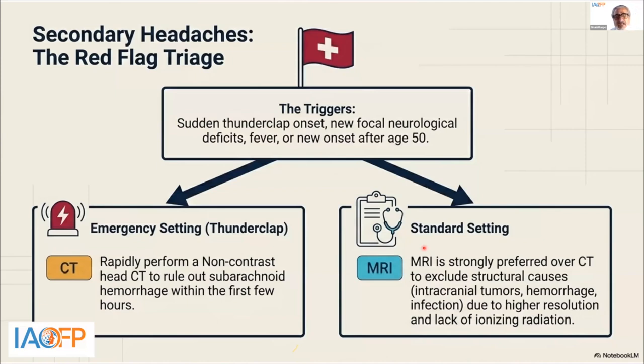For emergency, start with a non-contrast CT scan, not CBCT, and I usually always do that. I have no problem doing it as first line because sometimes you need to use the time, especially if the patient cannot see a neurologist for a while.